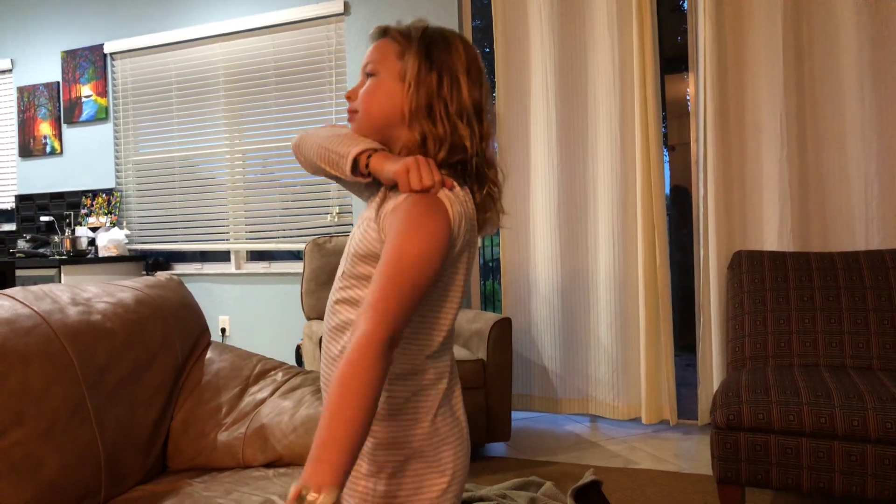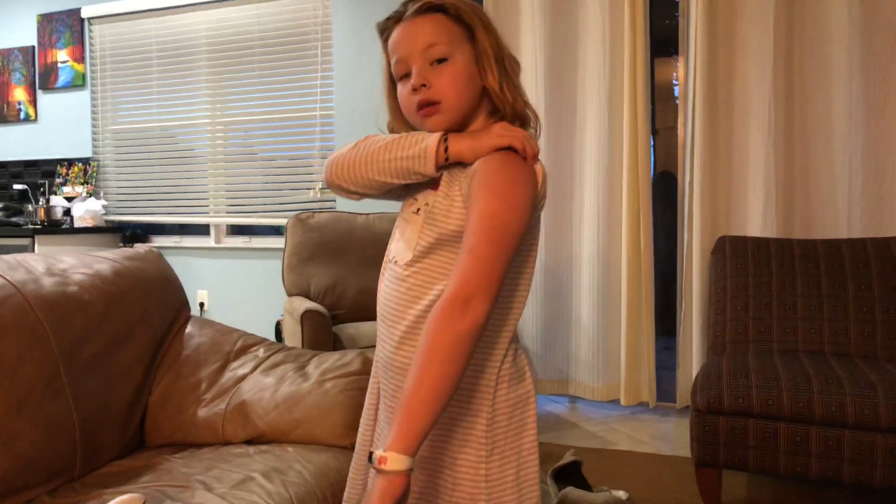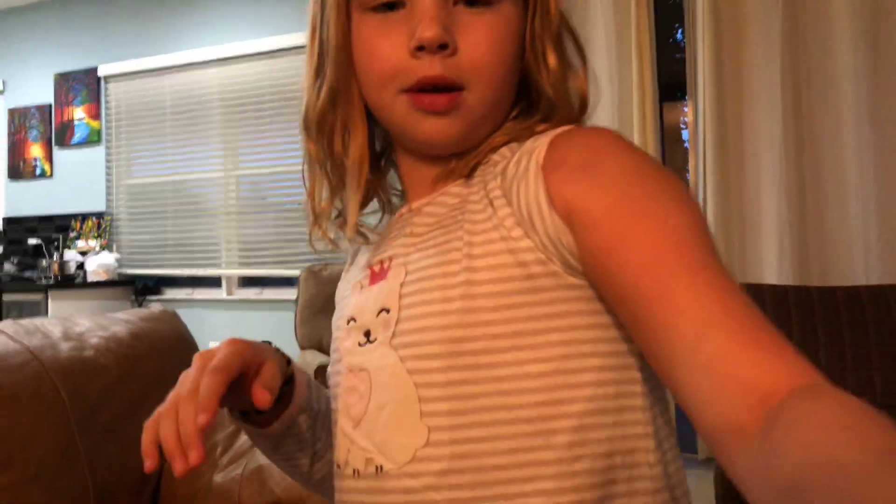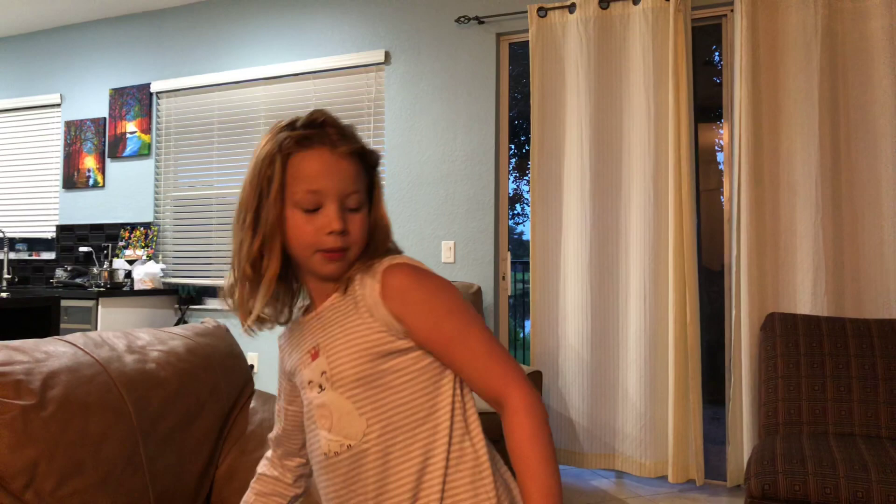Or he could talk and explain how to do it, right dad? Oh never mind, he's not coming in, but I'm still going to talk about it.